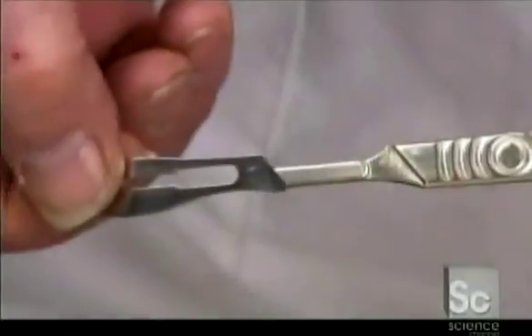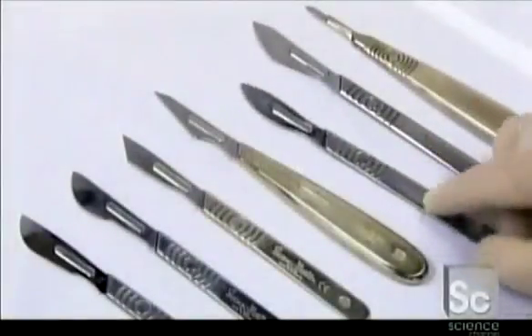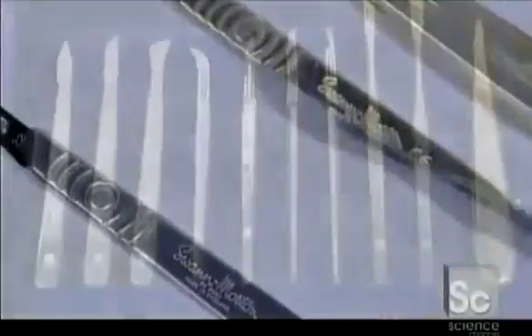In the operating room, it's simply a matter of sliding the blade onto the protruding part of the handle, called the bayonet. Surgeons make the most of their dexterity by choosing a handle that best fits their hands and best suits the procedure their hands will be performing.